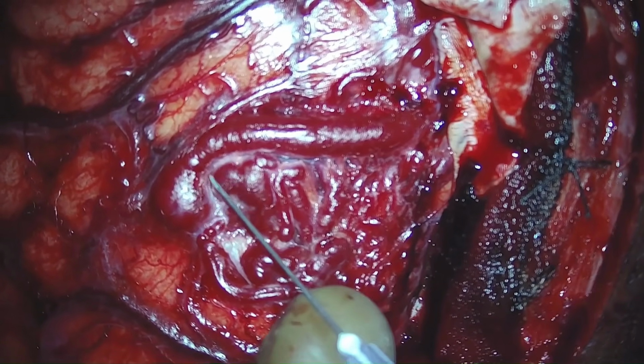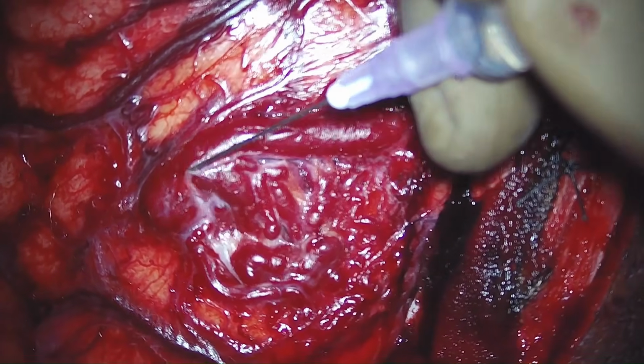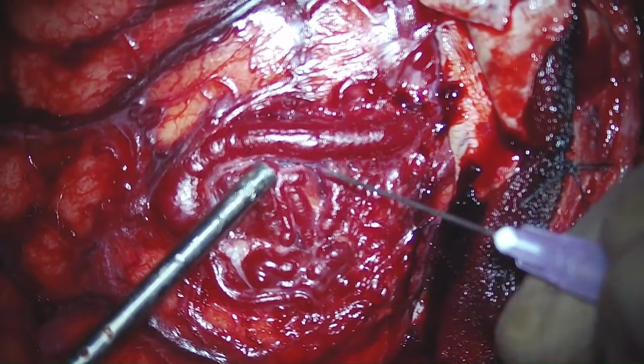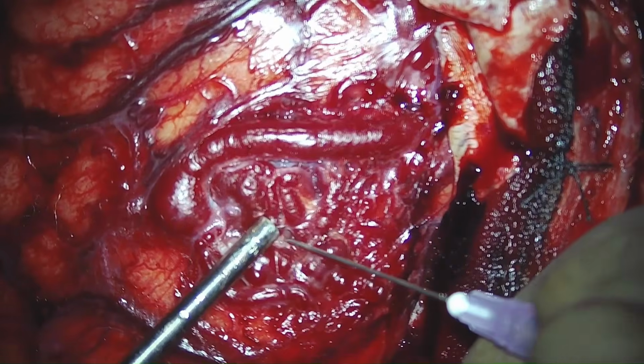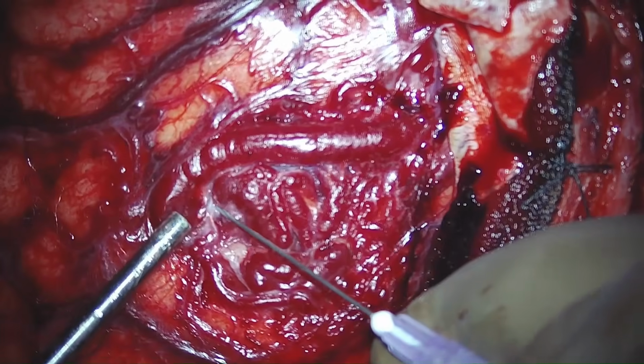As the vessels are very friable, it has to be done meticulously without any bleeding. So the arachnoid dissection is done very slowly, and slowly all the veins of the AVM are skeletonized.